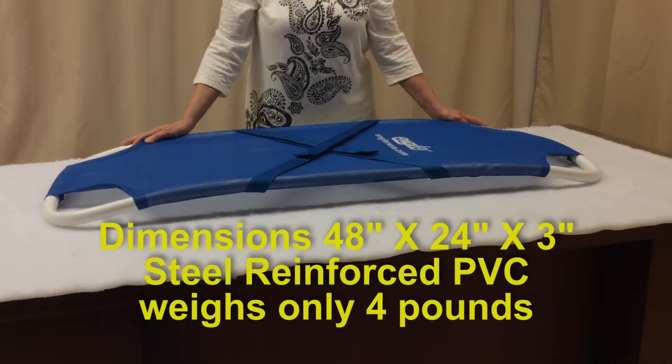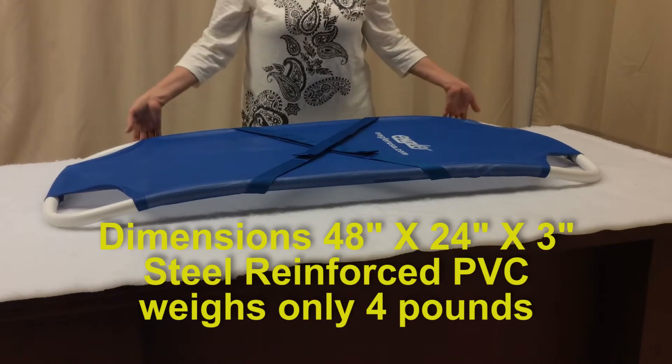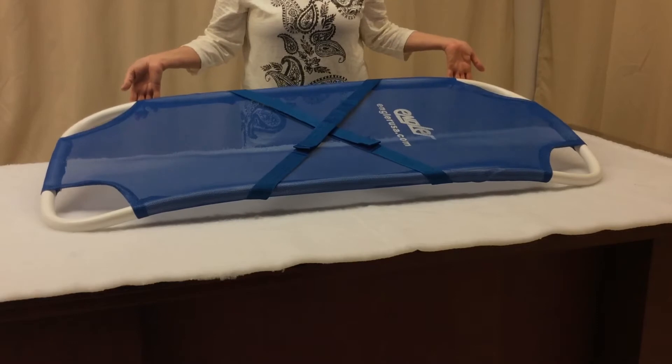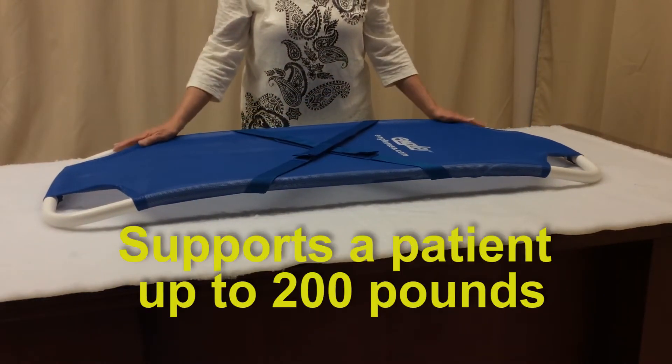Although it is made out of steel reinforced PVC material, it is lightweight at near 4 pounds, and you can support a patient weighing up to 200 pounds.